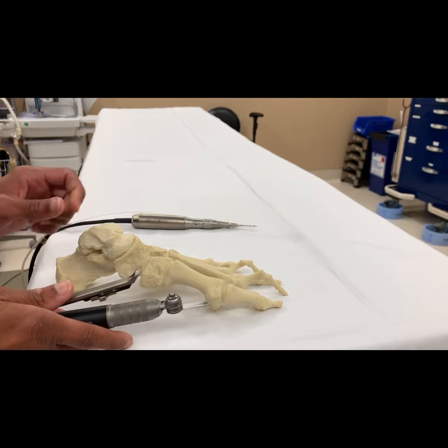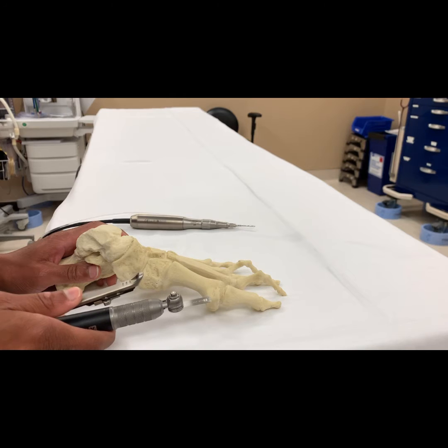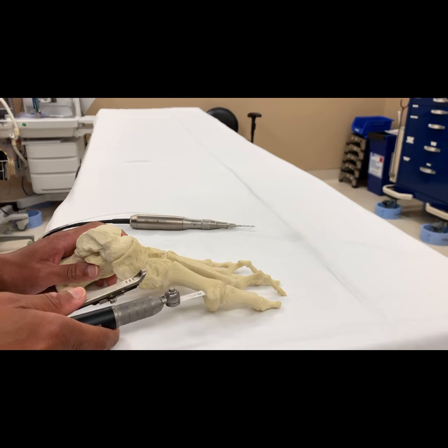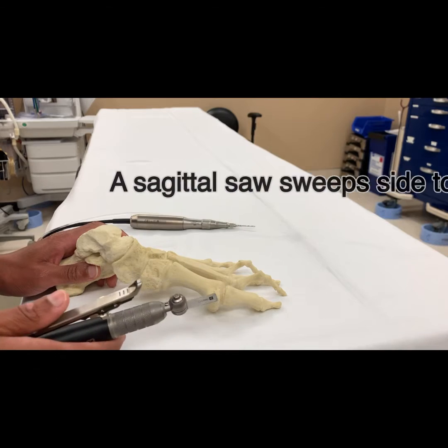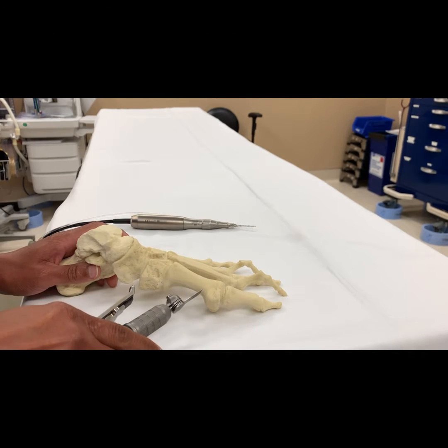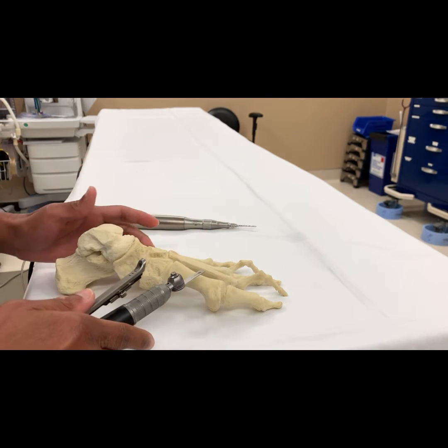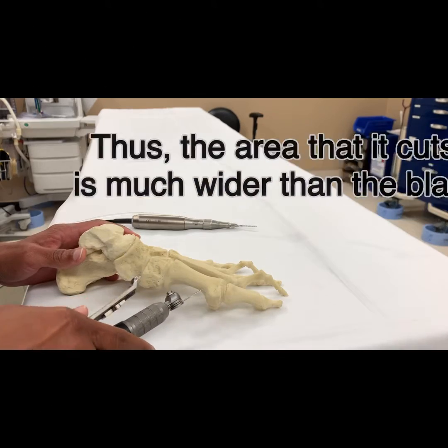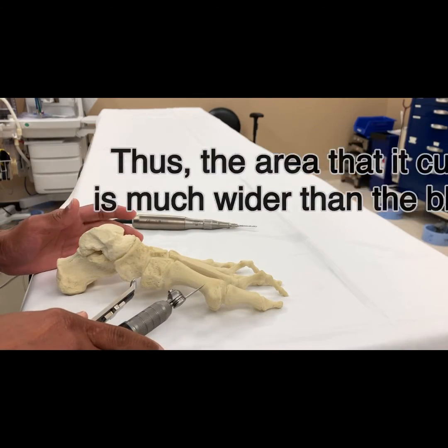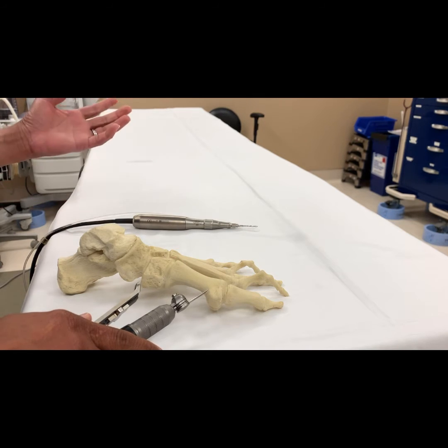In order to cut the first metatarsal for an osteotomy with a saw that has that much RPM, one has to make an incision large enough to accommodate the saw, and also to elevate the tendons over the top and bottom of the bone so that they are not cut. This is what we do all the time, and we're comfortable with it.